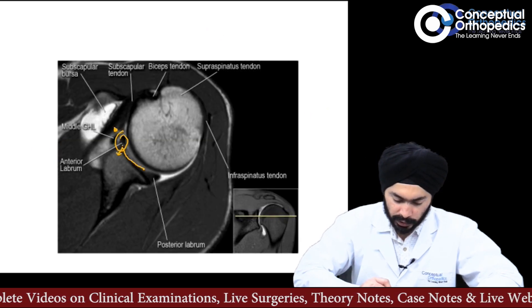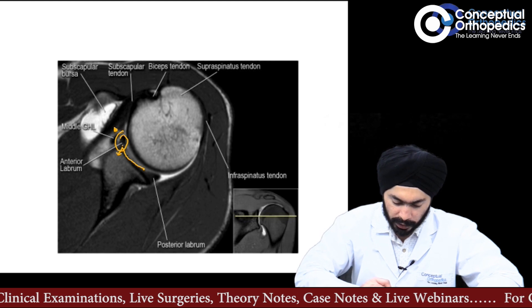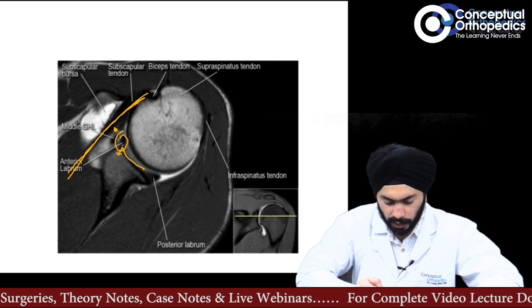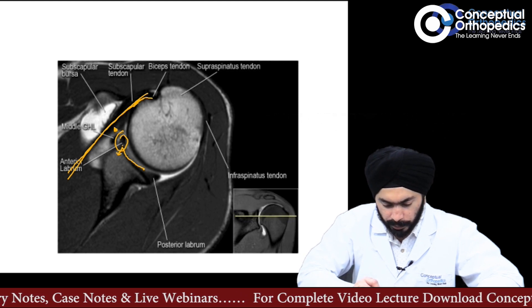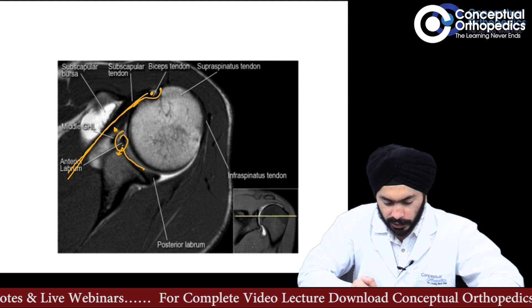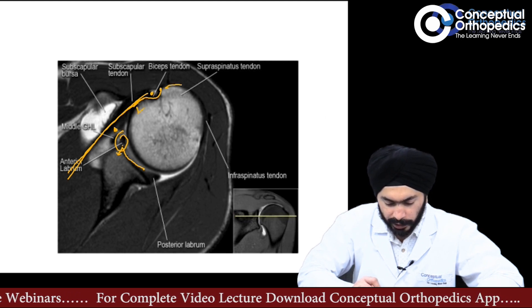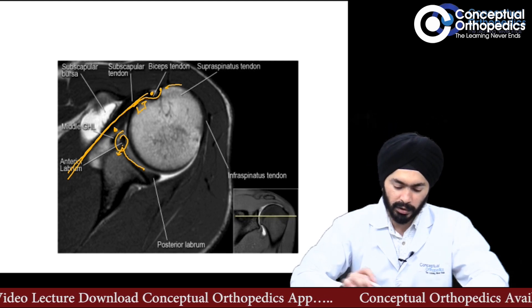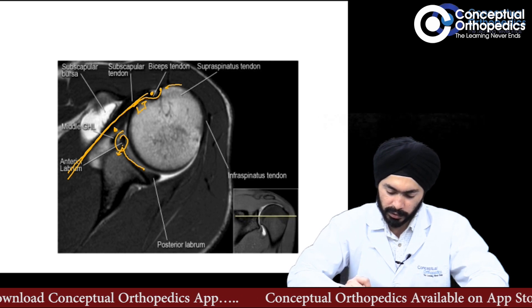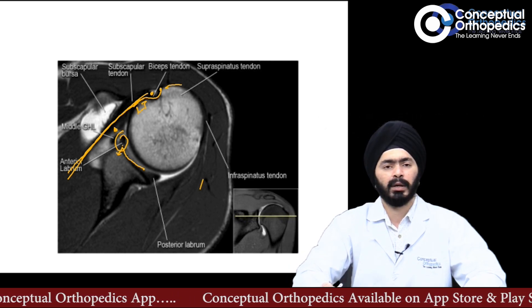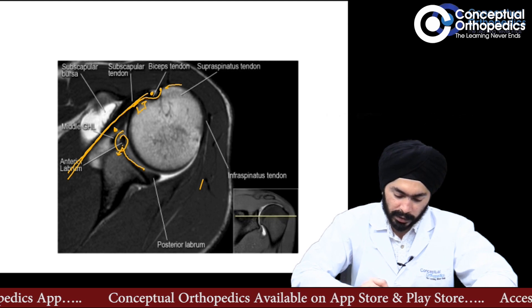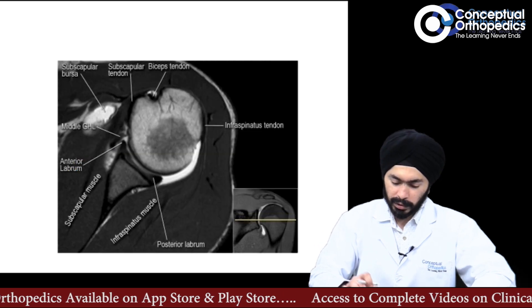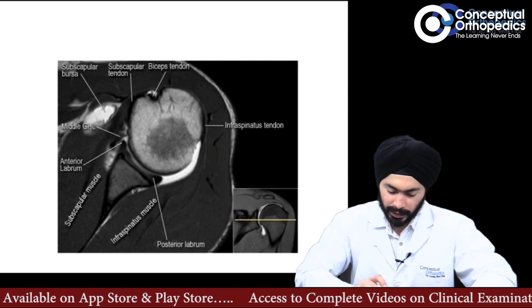Another important structure to identify: when you stop seeing the coracoid, you will see the supraspinatus muscle attaching on the greater tuberosity. This is the biceps groove, the greater tuberosity (GT), and the lesser tuberosity (LT). The subscapularis muscle attaches on the lesser tuberosity, and here posteriorly is the posterior cuff — the supraspinatus and infraspinatus. If there is a tear of the subscapularis, the muscle will be displaced and not attaching on the LT.